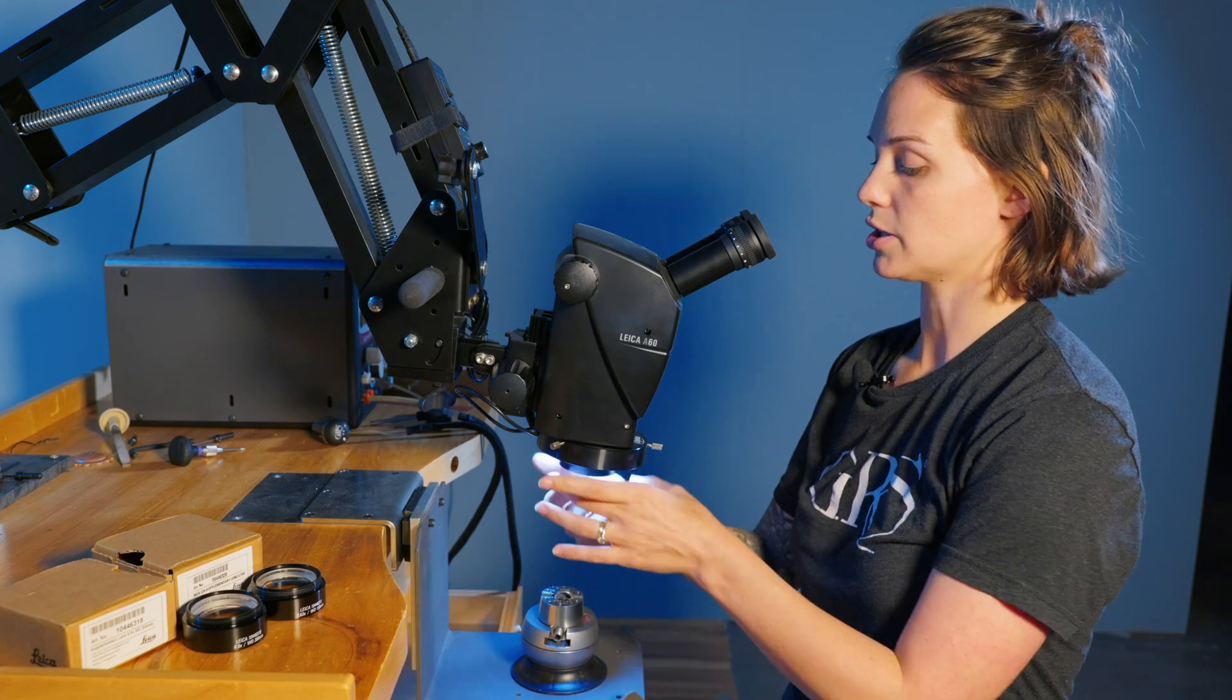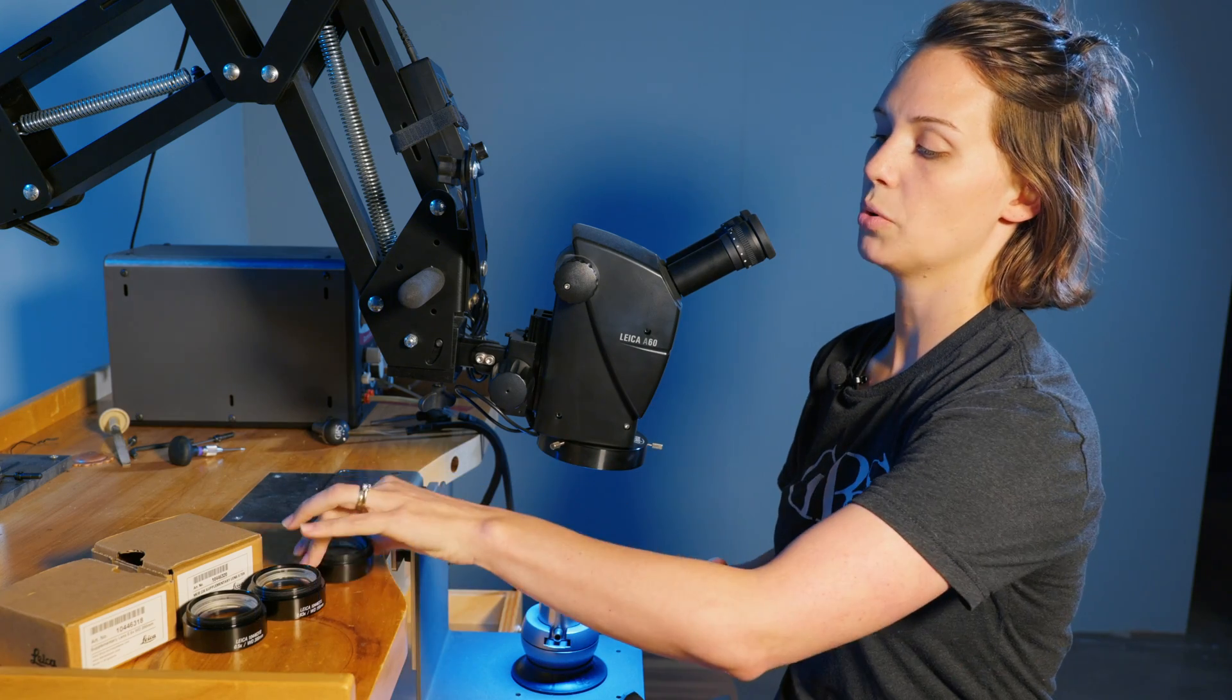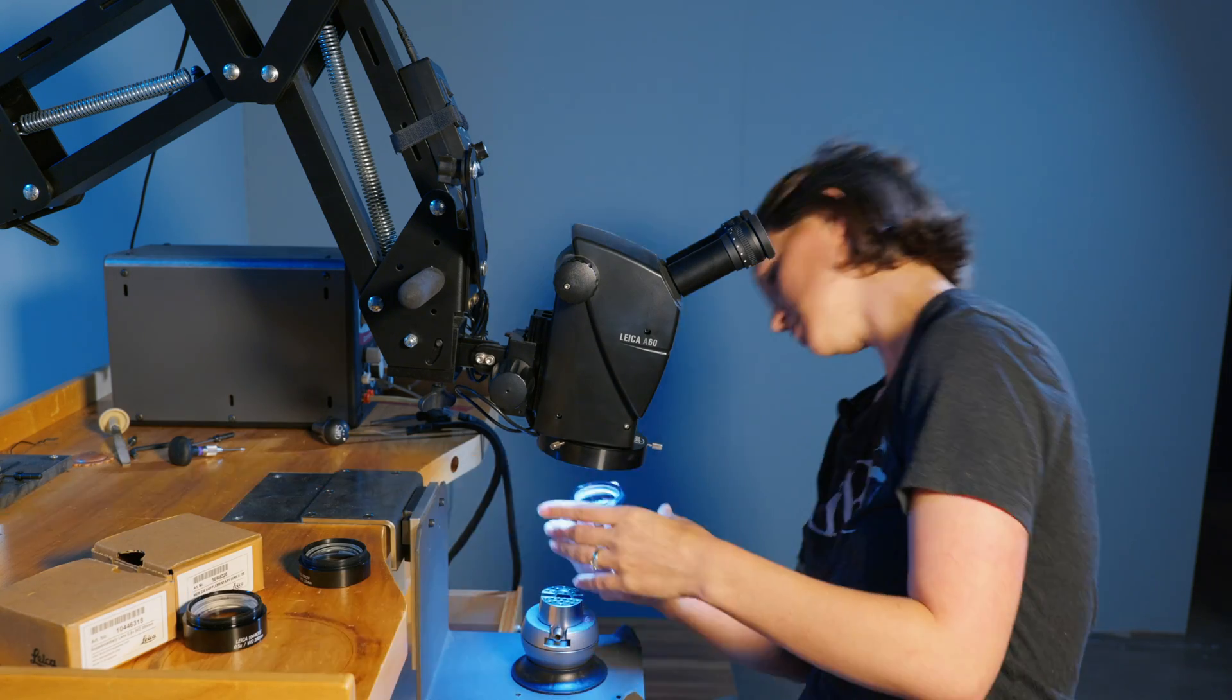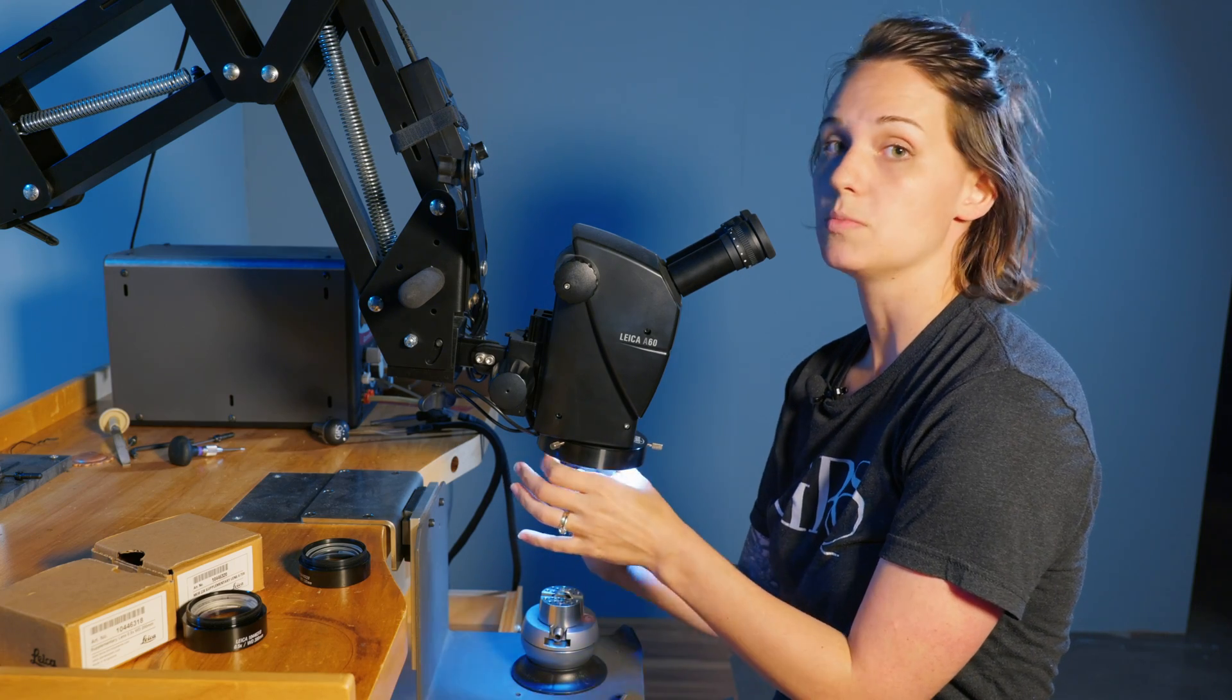If you're working on something larger, you might want to bump up to the next lens which is our 0.63. This is what we keep on all of our microscopes in the training center.